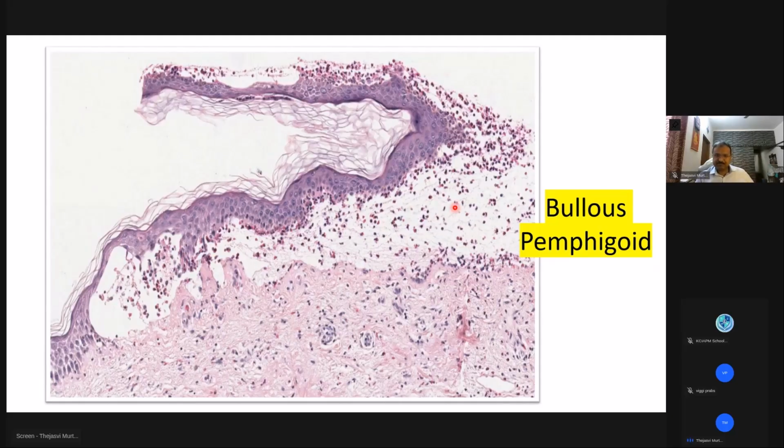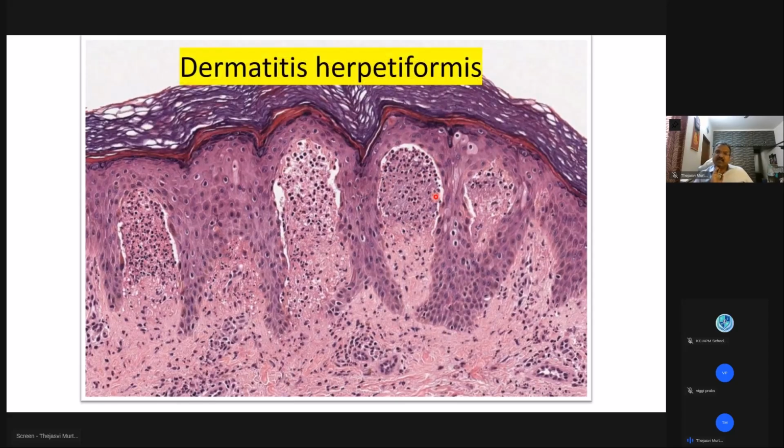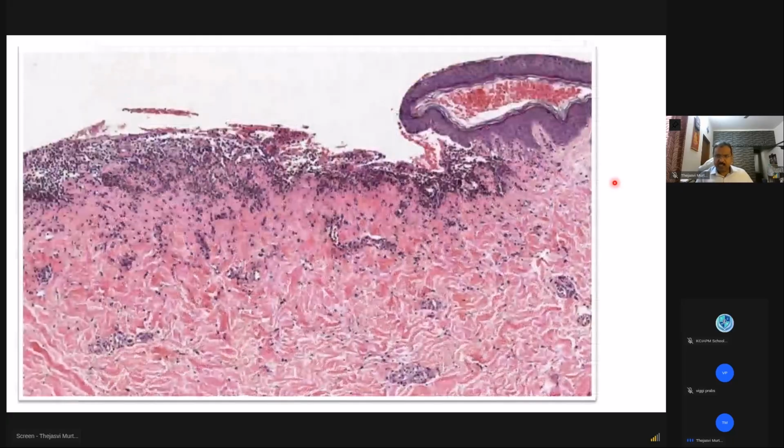Bullous pemphigoid. This also is a subepidermal bulla, but what is there here is a neutrophilic abscess in the papillary dermis. This is a very typical lesion. Here, clinical history also becomes important because there is gluten hypersensitivity. Here, this is dermatitis herpetiformis. Okay, dermatitis herpetiformis is a fairly common disease among young people with IgA immunofluorescence positivity. Papillary dermis, there are neutrophilic abscesses.